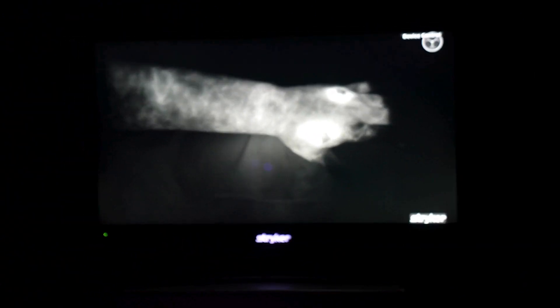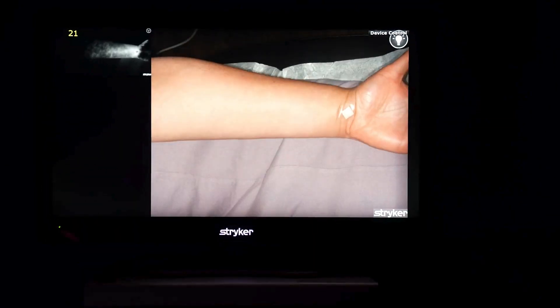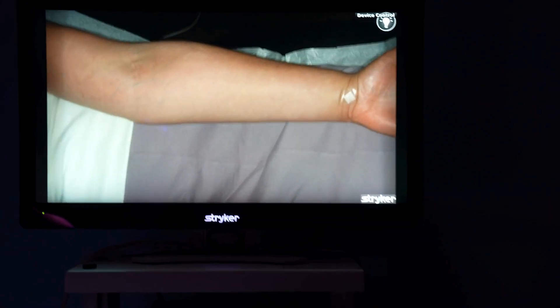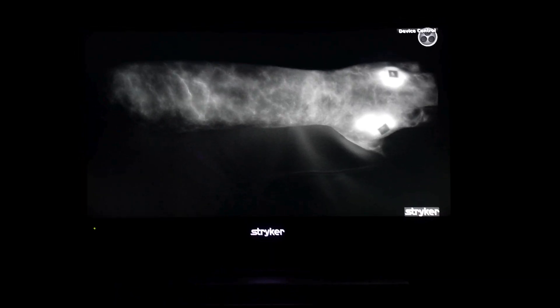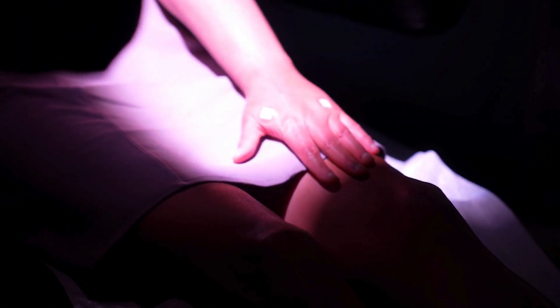It's trickling up here slowly but surely and making its way through the capillary bed. We're going to do a final set of photos. Flip your hands up.